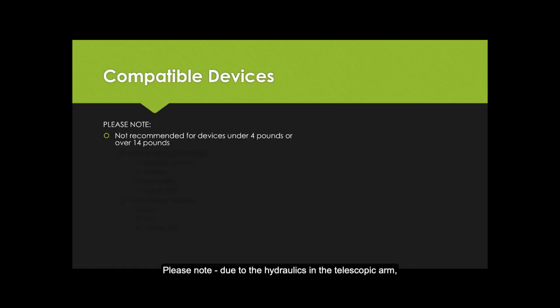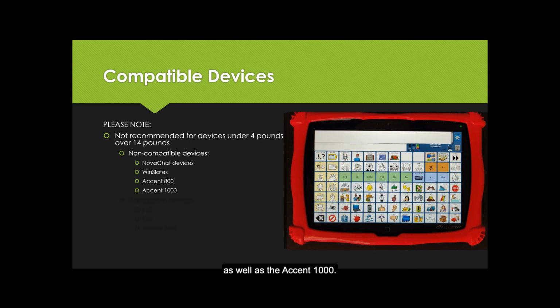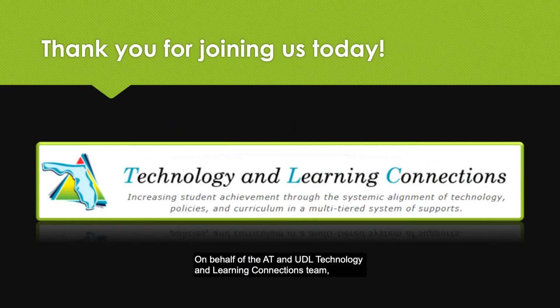Please note, due to the hydraulics in the telescopic arm, this device is not recommended for devices weighing under 4 pounds or over 14 pounds. Examples of non-compatible devices in our library include NovaChat devices, WinSlate devices, the Accent 800, as well as the Accent 1000. Examples of compatible devices in our library include the i13, the i16, and the Accent 1400, which does meet the minimum weight requirements.